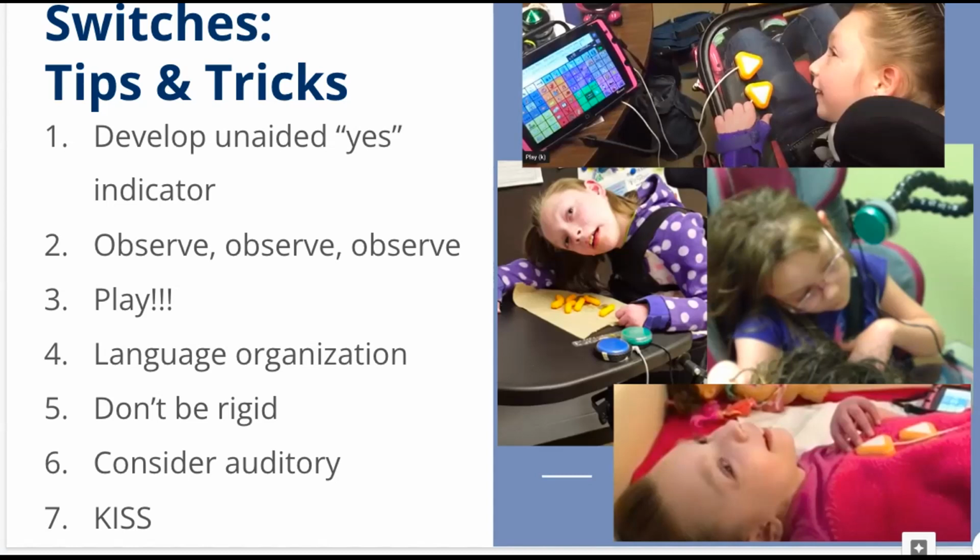And then, of course, the switches themselves are complicated enough. I add this, and it should be added to everything, but especially here, really think about keeping it simple, stupid, right? For some teams, like Haley's lovely candy corn switches, they require a battery.